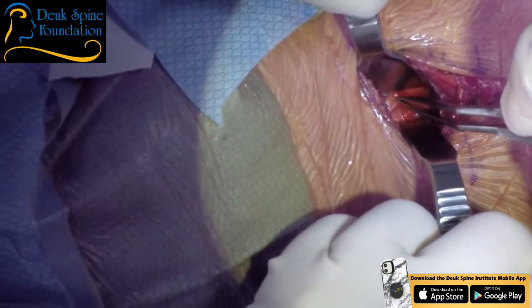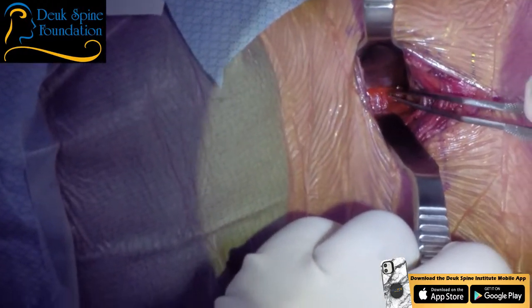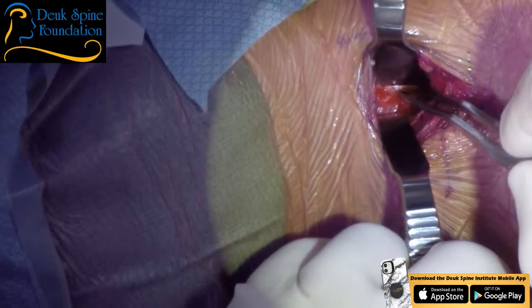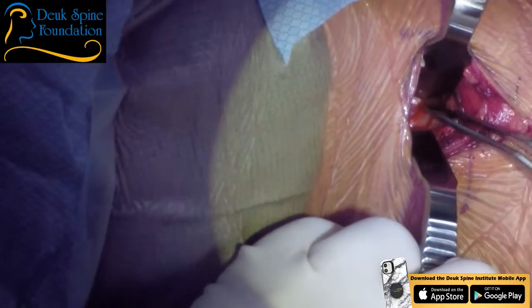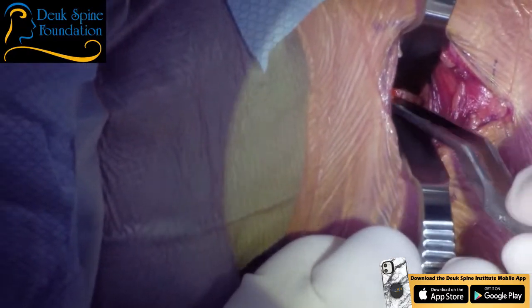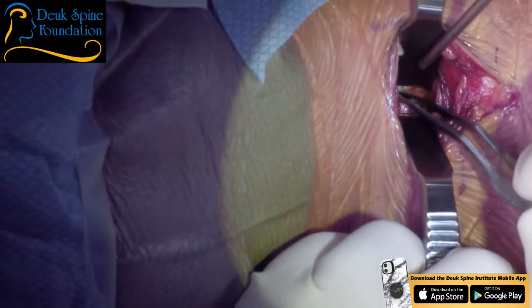Okay. I'm trying to sweep the soft tissue. There's 4, 5, we know, right? And then 5, 6 will be here. And what we need to do is I need a little bit more, just a little bit, Dr. Patel. See that? That's perfect, right? 5, 6, and then 6, 7. And our target is 6, 7, right? Mm-hmm. Yes, sir. Everybody's in agreement? I agree, sir. I think that's right here, to be honest with you. But we're going to make absolutely sure.